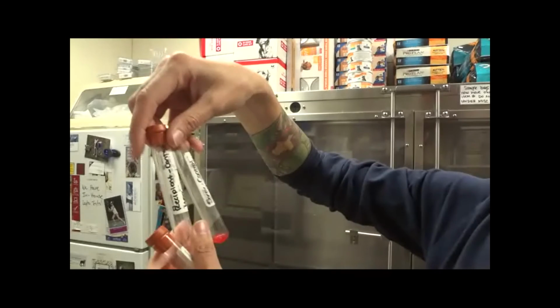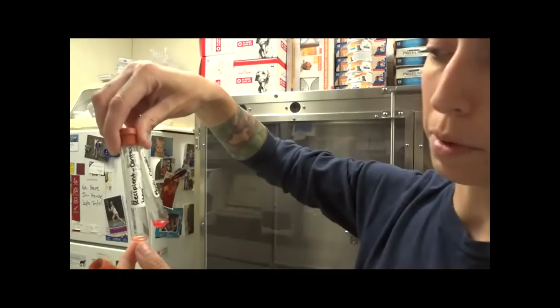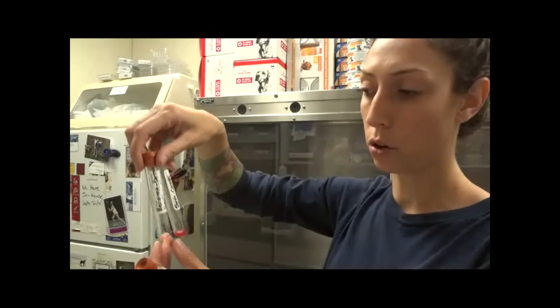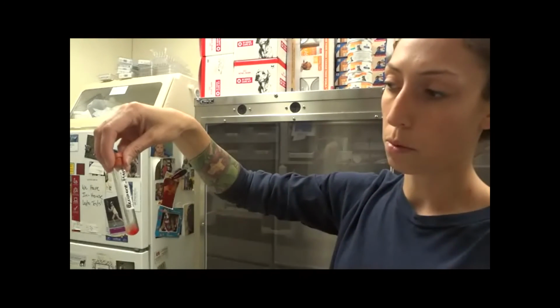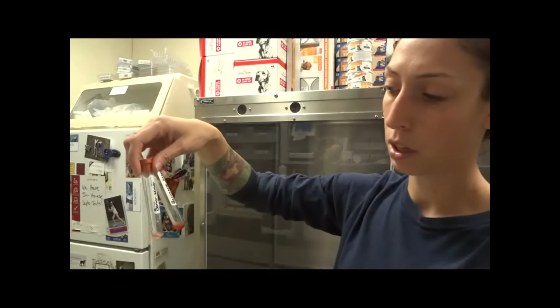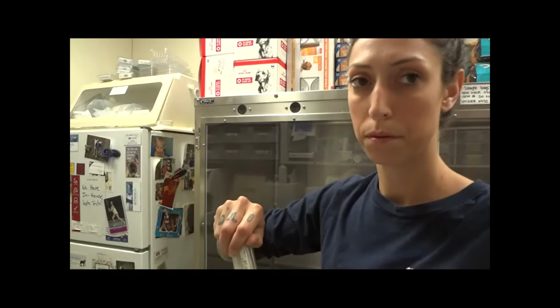Alright, so here we have our controls, where the recipient's serum and the recipient's erythrocyte wash have been mixed together, and the donor's serum and the donor's erythrocytes were mixed together. We have our major and our minor. We're going to allow these to incubate for 30 minutes before we centrifuge.